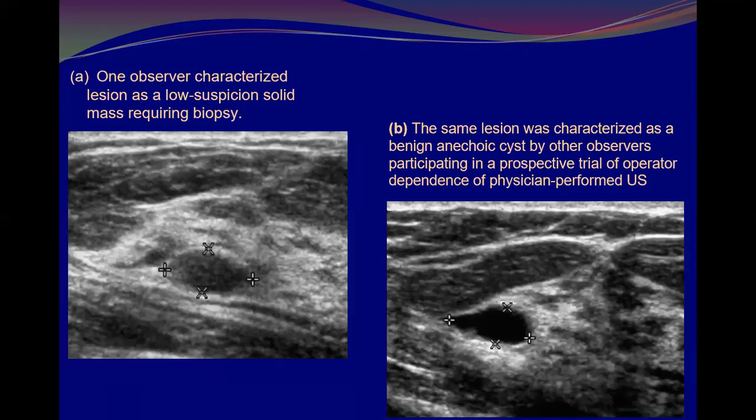B is, yes, more. You are right. What is wrong with the first image? It has an image with no, the border of the lesion is not clear, with the internal echoes appear on the other one. It's so clear. How do you know? This is not the correct one, and this is the correct one. It's even the surrounding tissue.